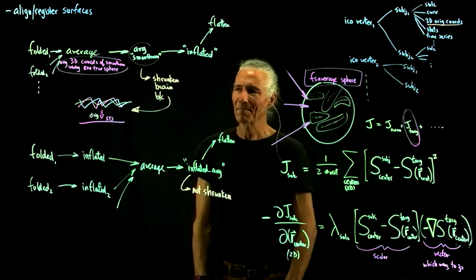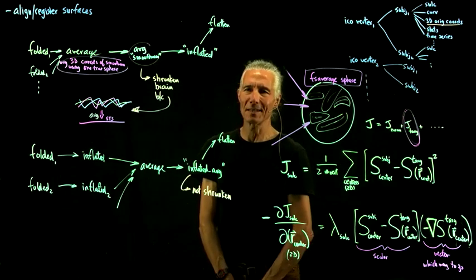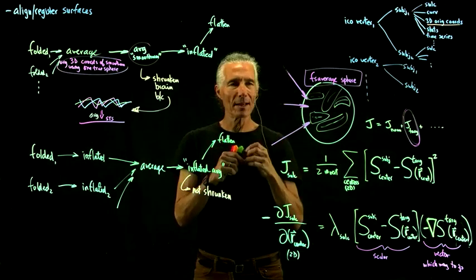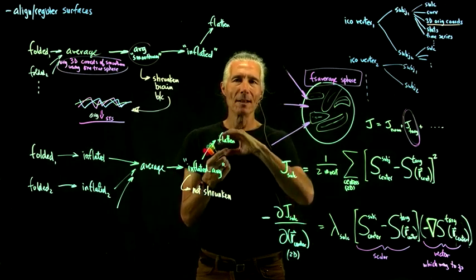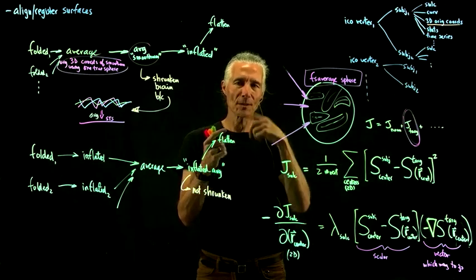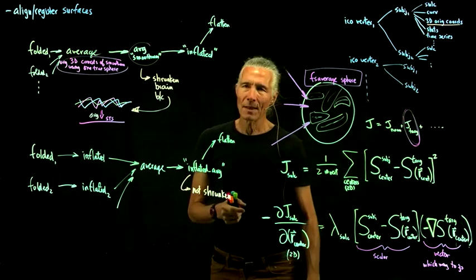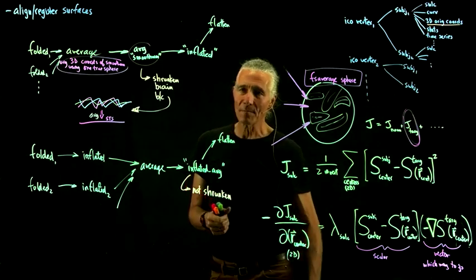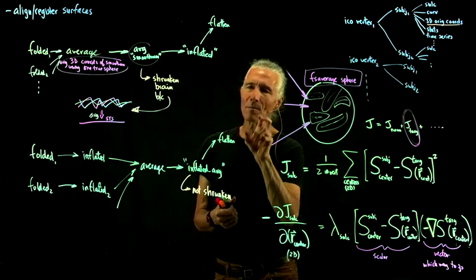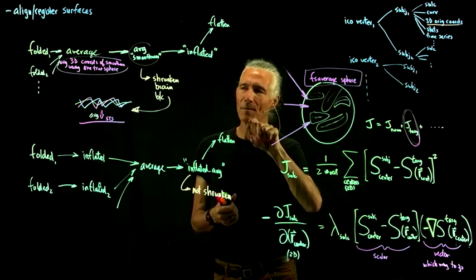So that's sort of surface-based statistics. The main advantage of this is that if you take an area that you can map by other means, like area MT, because you can do visual mapping and find out where area MT is and then outline it, or area V1, which is very easy to map, you have an independent measure of where V1 is.